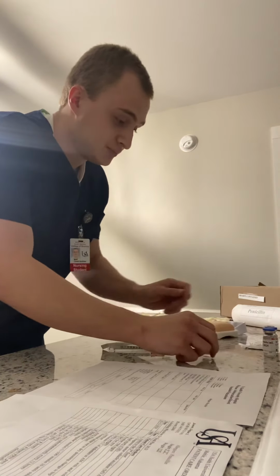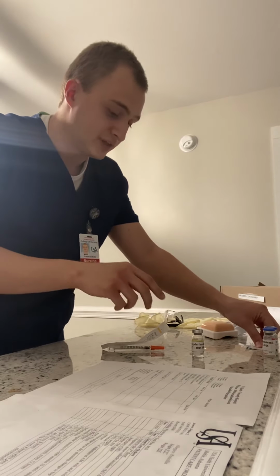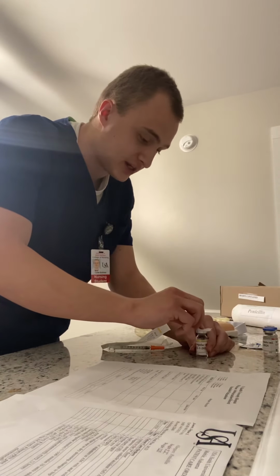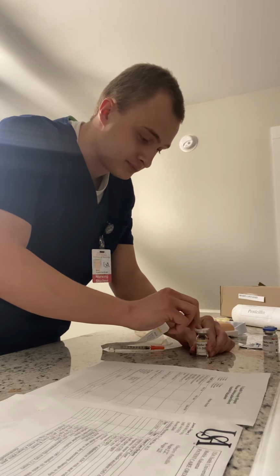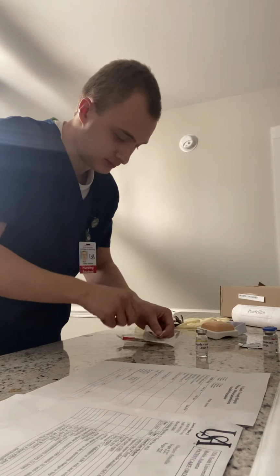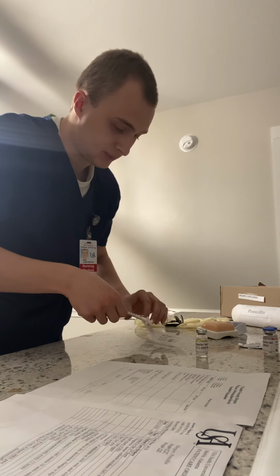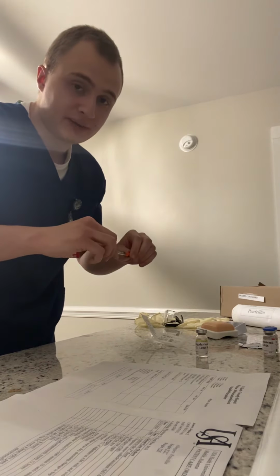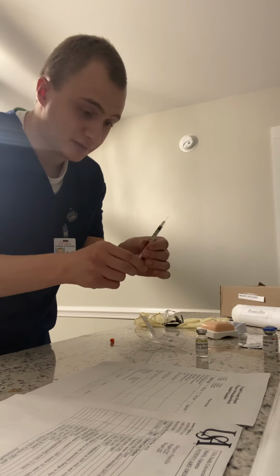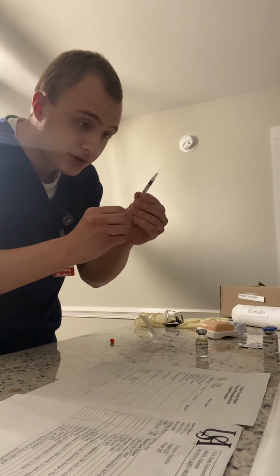Okay, next thing I will do is cleanse my vial with a brand new alcohol pad going in a circular motion. I will now remove the cap from my insulin syringe, withdrawing 10 units of air per the order.